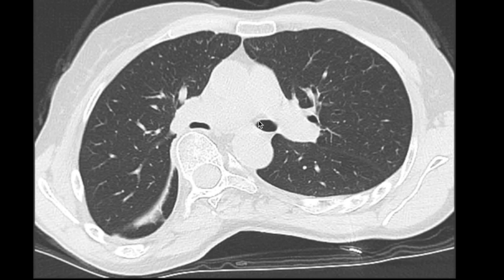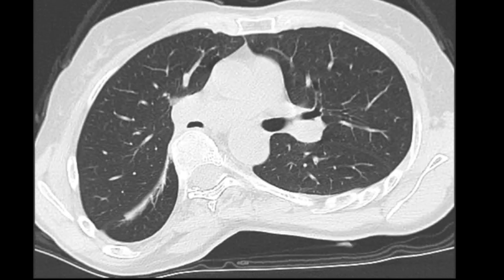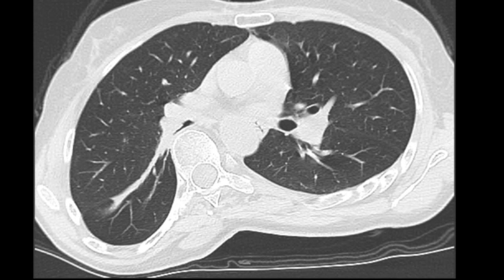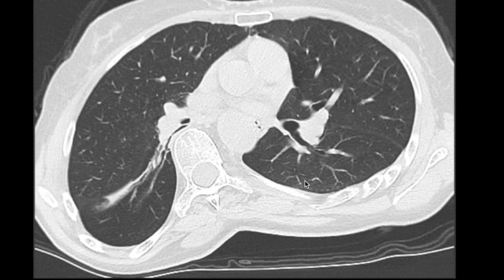Here we can see the left main bronchus is patent and looks normal. Have a look at the right main bronchus, it's really narrowed here. And you have to remember that the CT is taken during inspiration. There's some resultant atelectasis down the bottom of the right lung. And as we follow the right main bronchus down, the right lower lobe comes off in a very narrow opening. So there you can see the air getting through. It's patent, but it's extremely narrow.